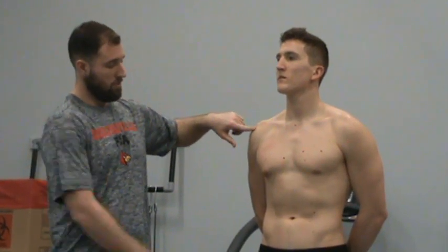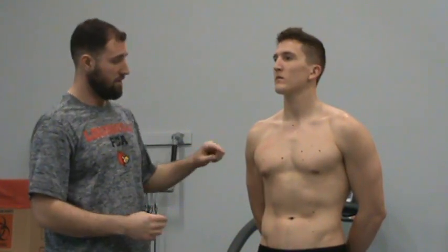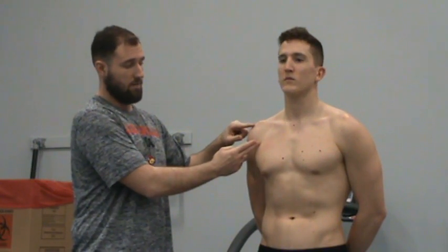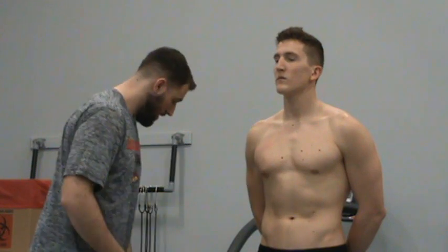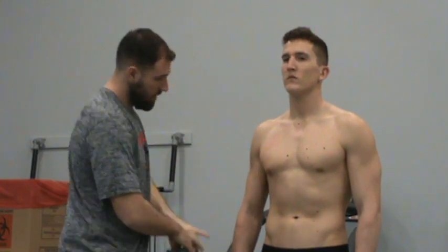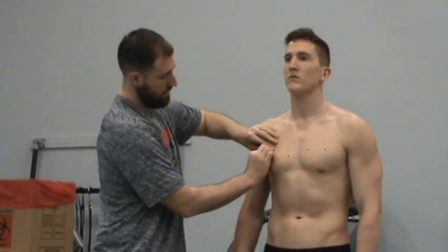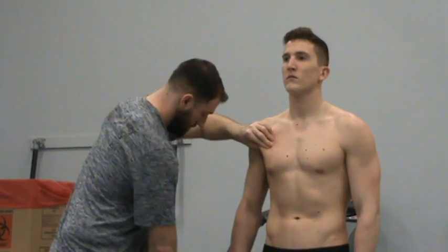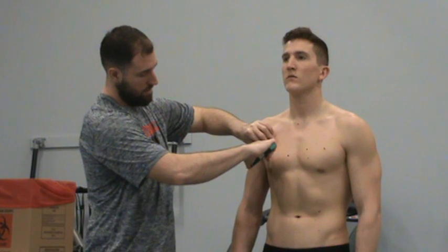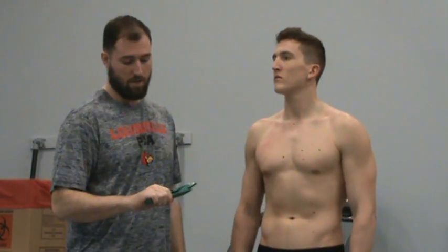I'll go ahead and start with the chest here. For men, I'm going from his shoulder to his nipple, about halfway in between, and I'm making that pinch. For females, it's going to be a third of the distance, to get out of the way of breast tissue. So I'm looking at his shoulder joint, nipple, about halfway in between. I get my pinch with two hands, kind of roll it up. Once I'm good, I go just below where my thumb is and get my reading. That was about eight.